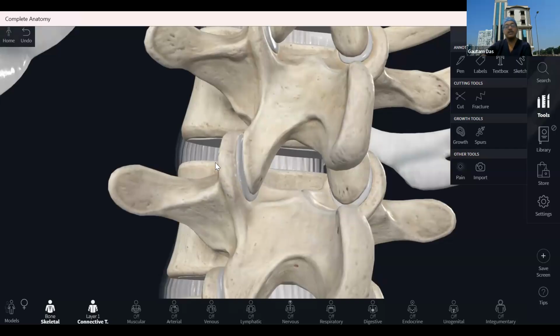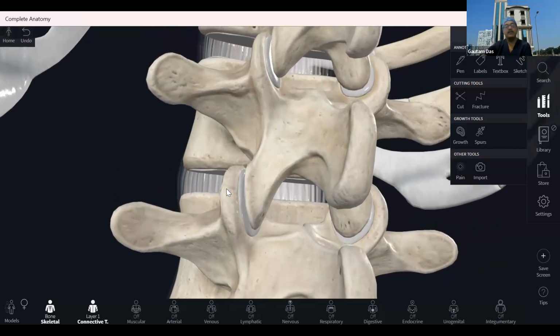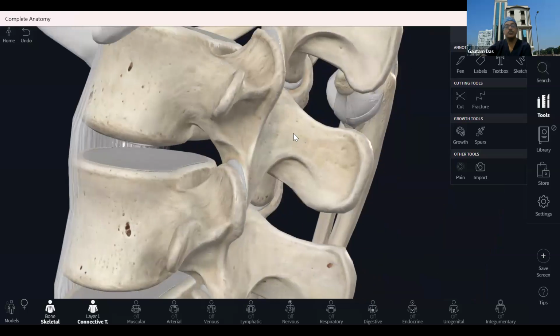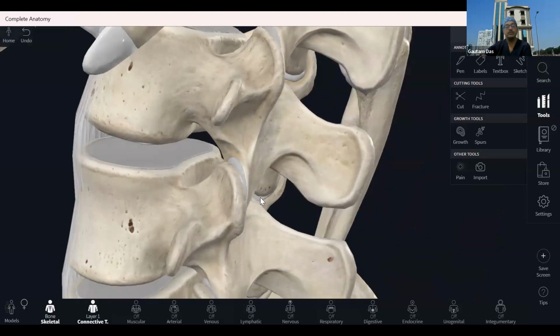So in this mammillo-accessory ligament, the medial branch will be blocked, and we'll be able to see that. Apart from that, when we hold the probe from the transverse process view more medially, we'll be able to see the mammillary process view. Suddenly, you'll see the height increasing, because this mammillary process is the most projected part.